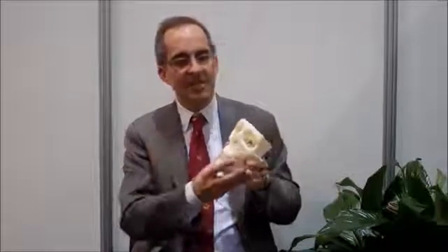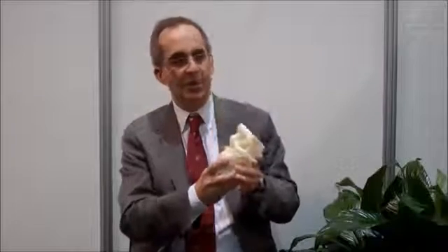3D printing is somewhat different in so much as it's the same CT data that we use, but that CT data then undergoes specific algorithms, because the DICOM images, which is the standard method for formatting CT images, is not amenable to printing. Those DICOM images need to be transformed into another language. They're called STL files. STL stands for Standard Tessellation Language. And the way that we do that is we use two software packages from Materialise, Mimics and then 3-Matic. Mimics is similar to segmentation software where we can crop out things like the bone. And then 3-Matic is a computer-aided design package where we can prepare the STL files, make them watertight and then amenable to printing.